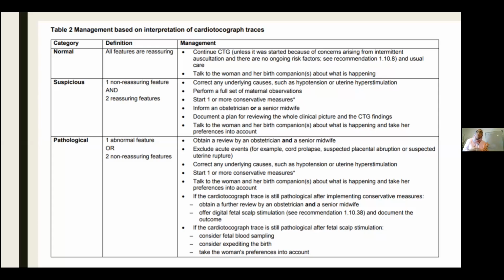It's uncomfortable for her. So you keep chatting with her and tell her the color of the hair of the baby. If there's not much hair on the baby, you shouldn't tell that, but you can give some information about the scalp. Then you are going to put some Vaseline on the baby's head. And that would make the blood drop into a nice drop, and you actually scratch the head. It doesn't hurt them. So tiny, tiny scratch. And then you take the blood into a little pipette and you put it in your machine, which is the arterial blood gas machine. And that machine tells you about the oxygenation of the baby.